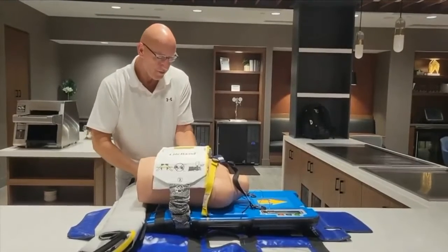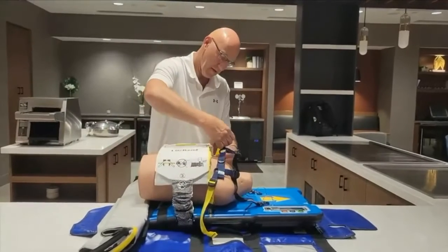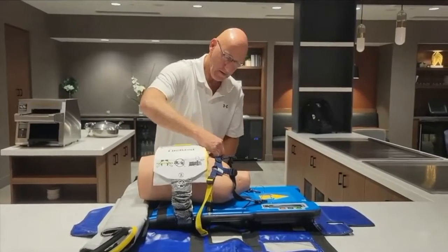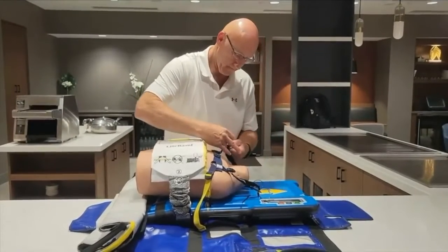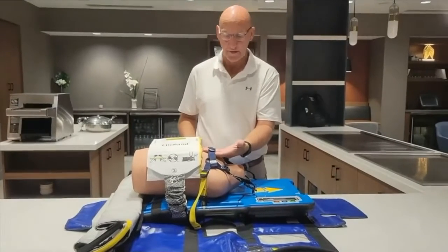When you go to secure the patient, we always secure the yellows first, then come back and do the blacks. We then ask providers to double-check by putting their fingers underneath the navy strap.